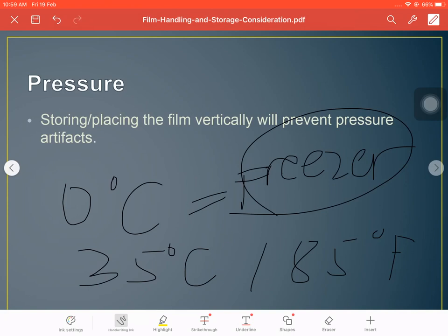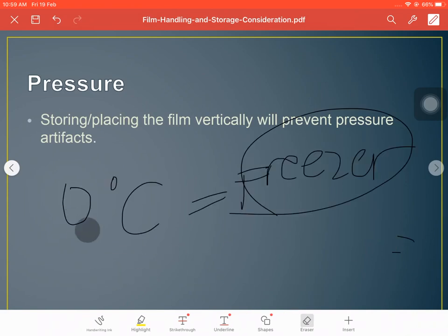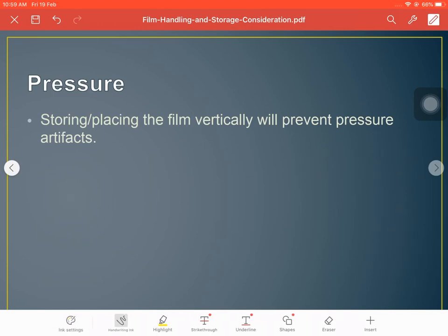Another one, the reason why we should have a ventilation process is to avoid a higher temperature within our dark room. Diba nasa dark room ang storage room natin? Because a higher temperature can rapidly age our films. Mabilis may expire yung film. Kahit hindi yan gamitin, basta mainit yung temperature ng storage room nyo, magkakaroon ng rapid aging process.